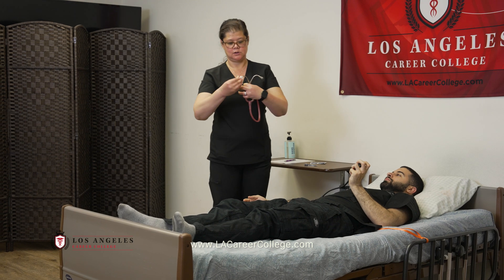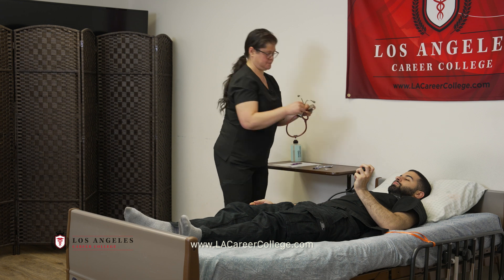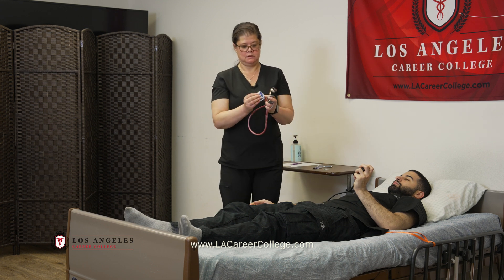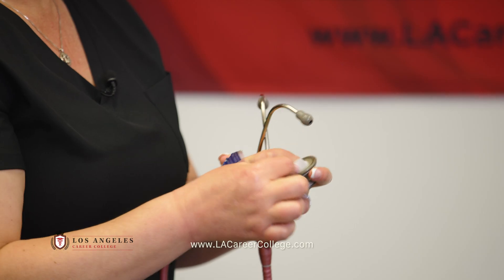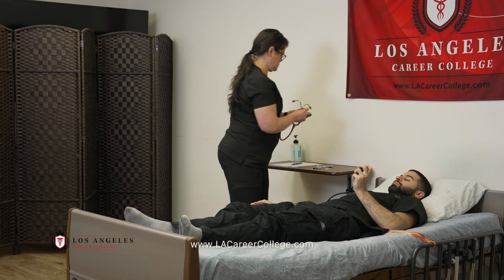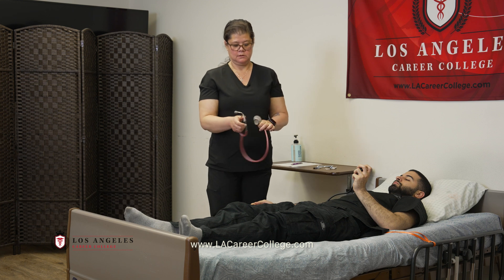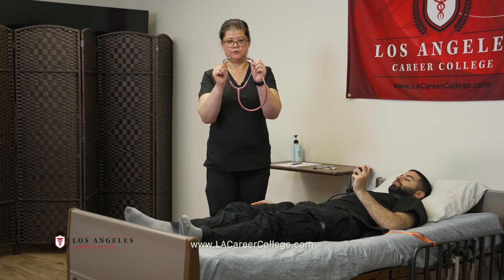Going to clean the stethoscope ear pieces and also the diaphragm. The ear tips should point forward.